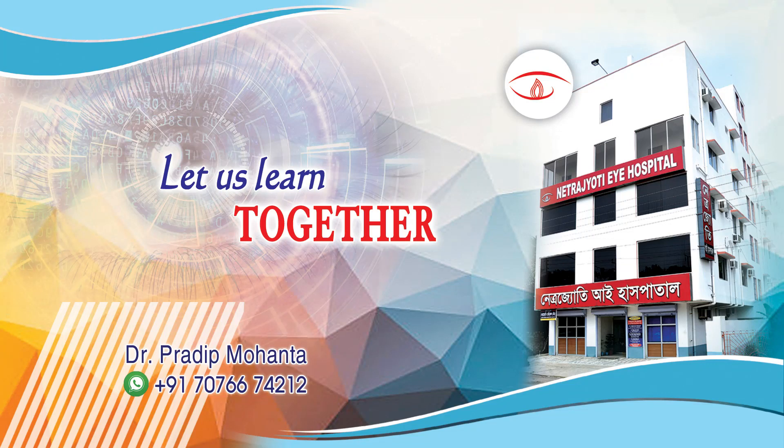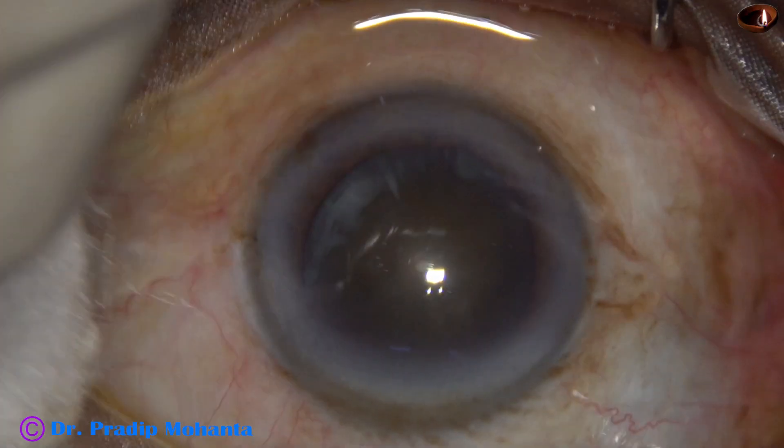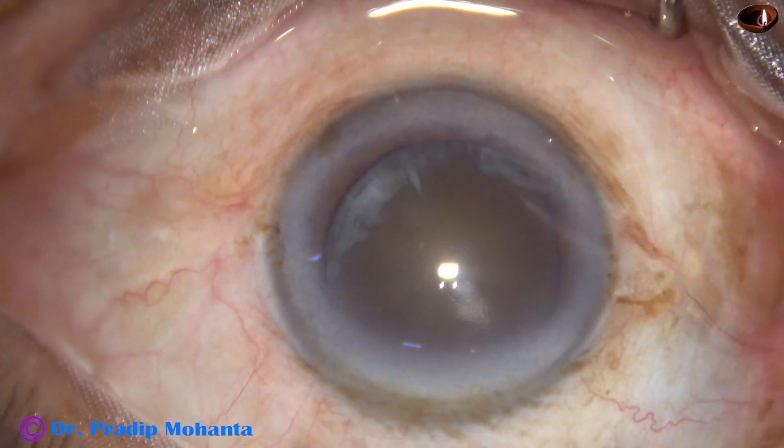Friends, welcome to my workplace at Ranakha, West Bengal, India. This is a hard cataract and this is a totally unedited recording. Let us observe this surgery.